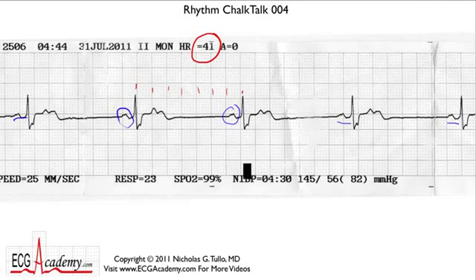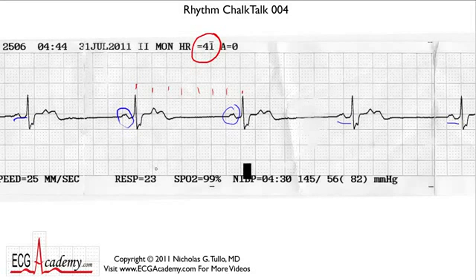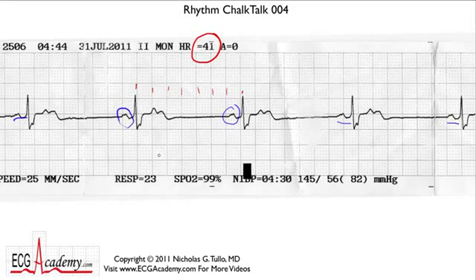But there's something going on here that's more than just sinus brady. And that's what these Chalk Talks are all about — getting you used to looking for things out of the ordinary, things a little more advanced than what you'll see in the textbooks.